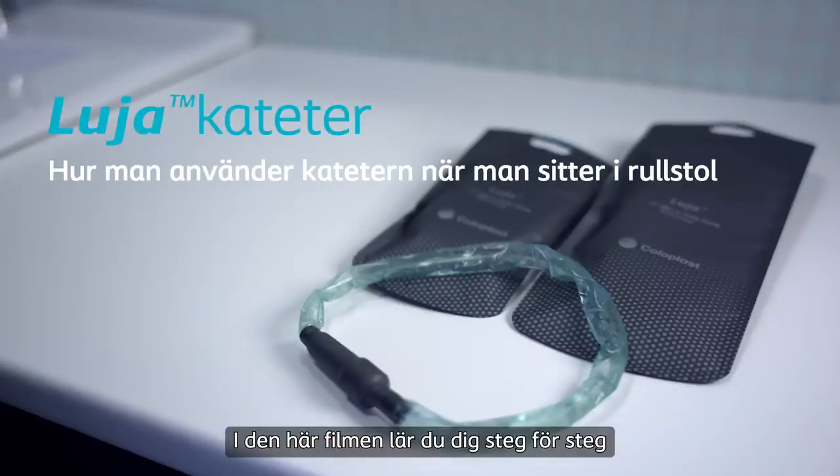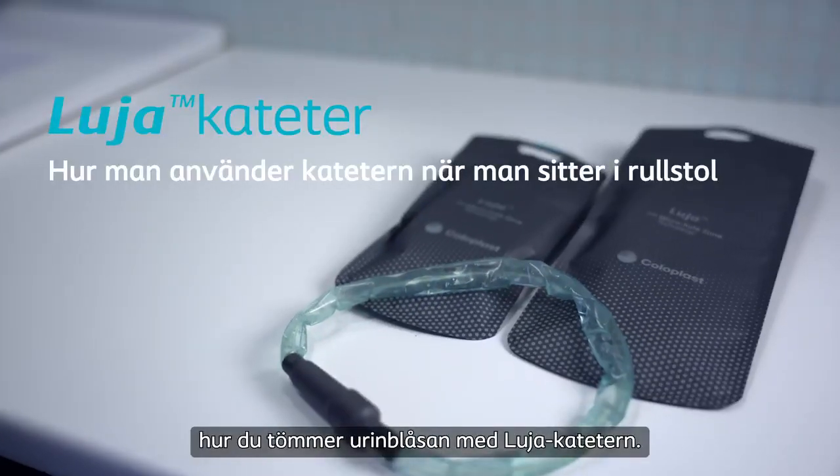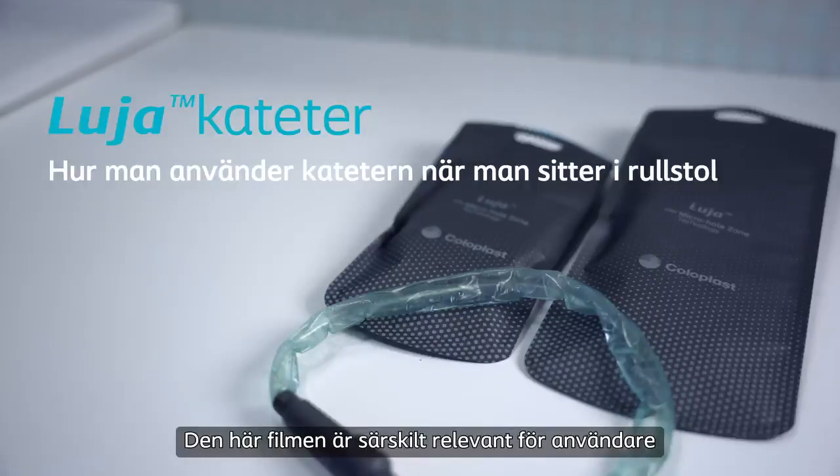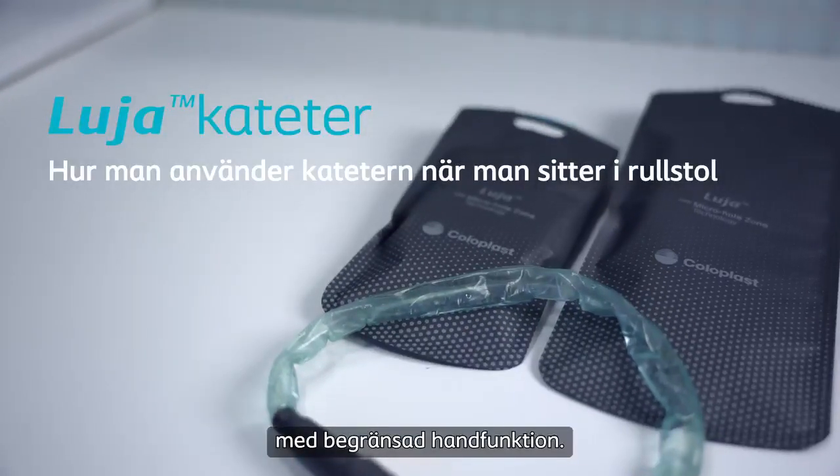In this film you'll learn, step by step, how to empty your bladder using the Luja catheter. This film is particularly relevant for users with limited hand function.